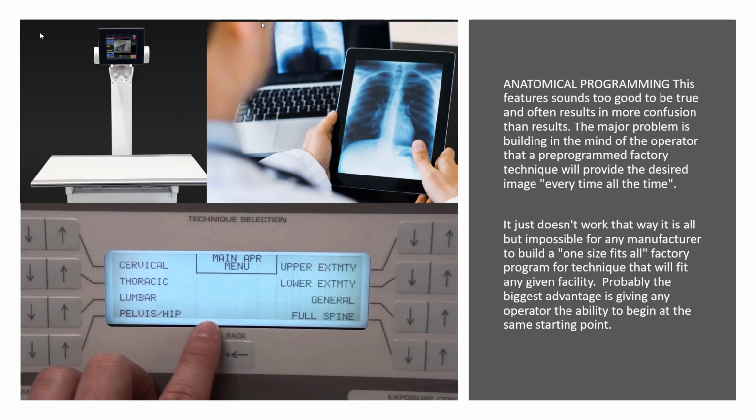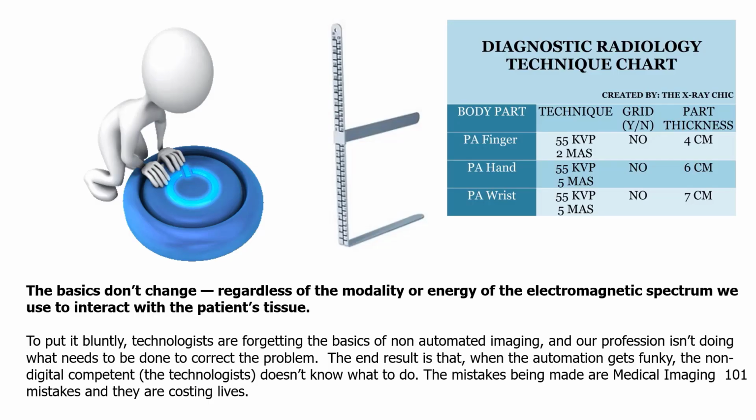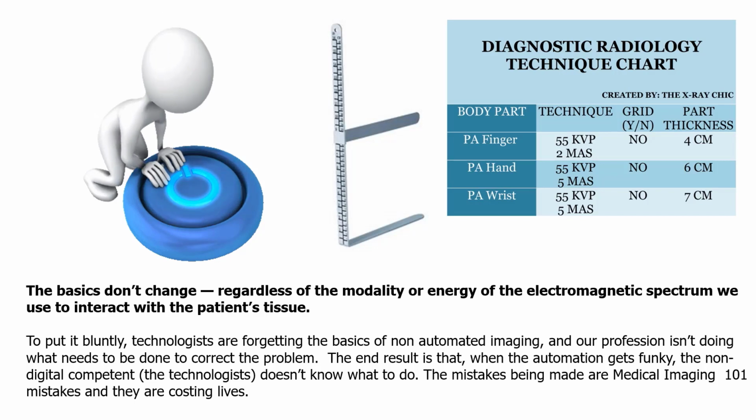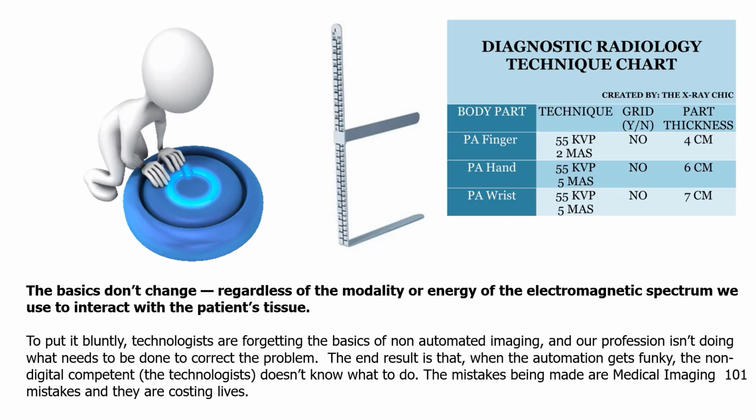Probably the biggest advantage is giving any operator the ability to begin at that starting point and modify the techniques for their facility. The basics don't change, regardless of the modality or energy of the electromagnetic spectrum we are using to create the image by interaction with the patient's tissue.